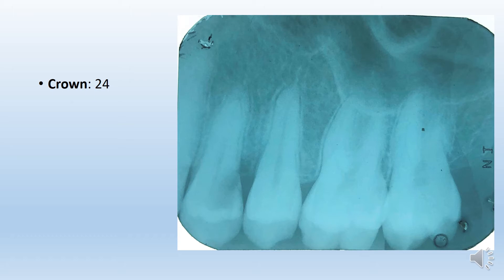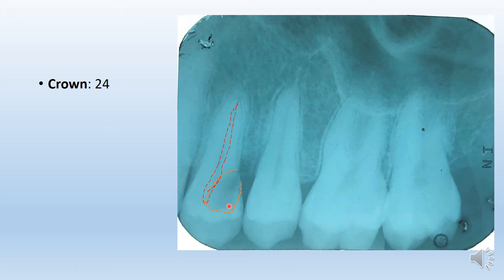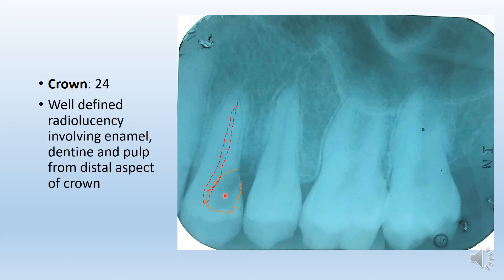We have identified that our tooth of interest is 2.4. Because we can see a radiolucency in the crown. This radiolucency, if you observe closely, is arising from the distal part of the crown and is extending to involve the enamel as well as the dentine. Moving on, you will see that it is actually involving the pulp of the tooth. This radiolucency most likely looks like dental caries, involving the pulp of the tooth — a well-defined radiolucency involving enamel, dentine, and the pulp.